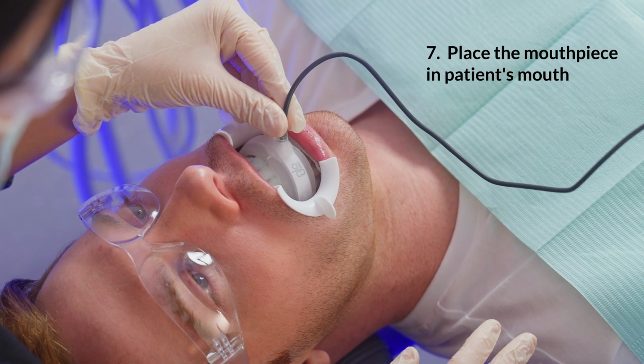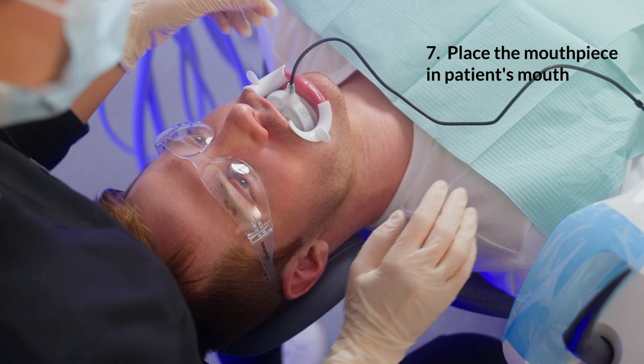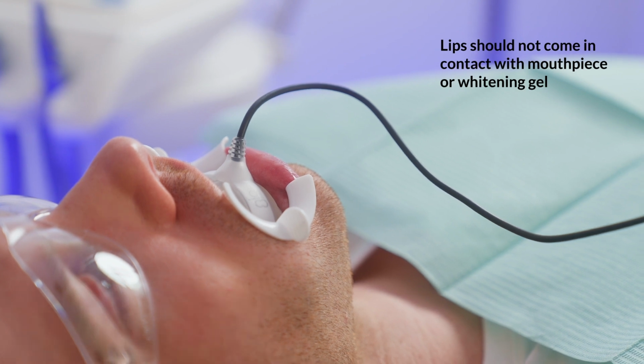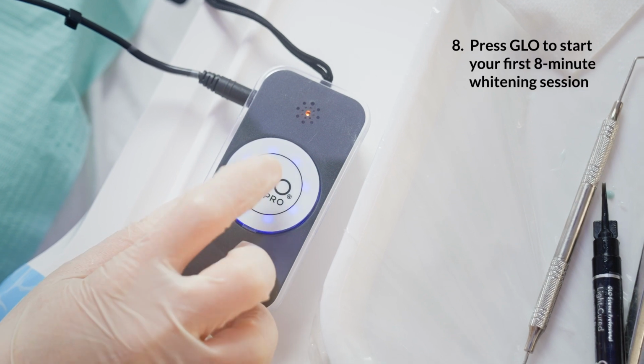Step 7. Carefully insert the mouthpiece one side at a time. The lip should not touch the mouthpiece or the whitening gel. Ask the patient to lightly close their mouth and to secure the mouthpiece. Step 8. Press the GLO button and start your first 8-minute whitening session.